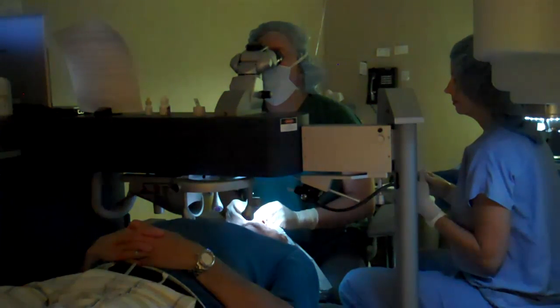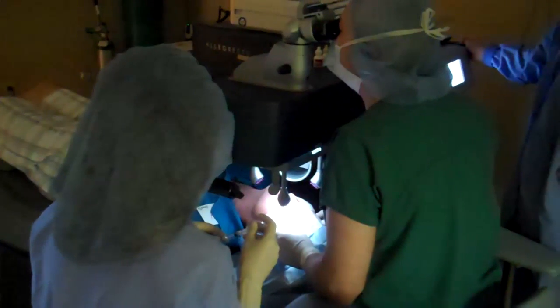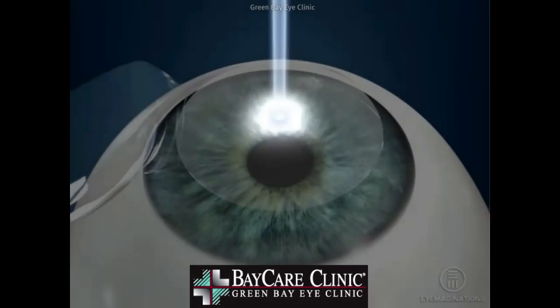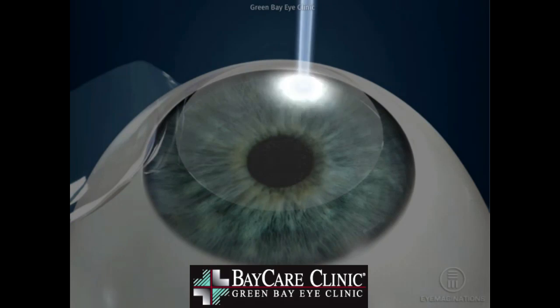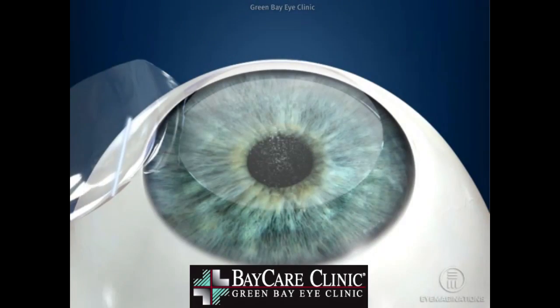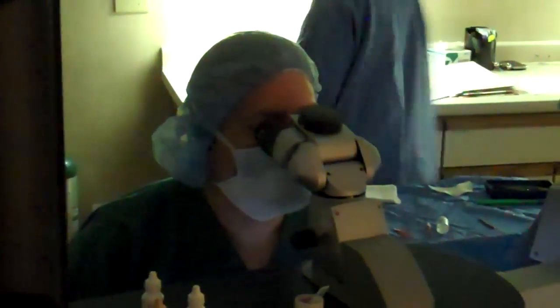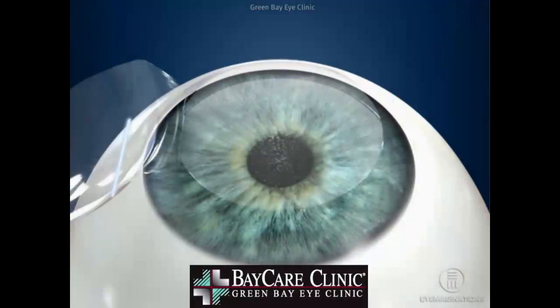The flap is then lifted and the actual laser treatment is then placed underneath the flap or onto the corneal tissue. This laser then removes corneal tissue selectively to create the treatment effect. In a nearsighted eye, more is removed from the center and less from the periphery, thus flattening the cornea. Our laser treatments are very quick today. They generally range in time from only about 5 to 20 seconds.